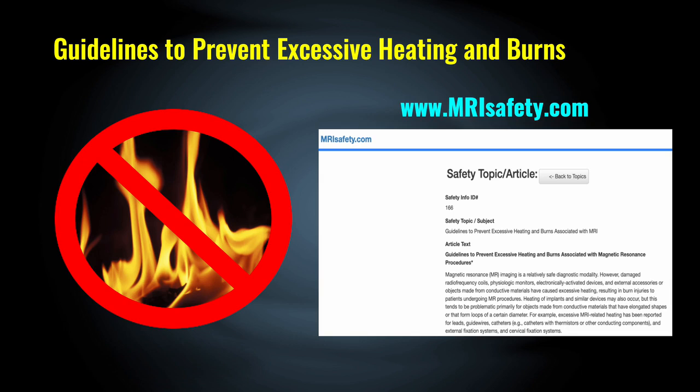The prevention of excessive heating and burns requires an understanding of the safety procedures for patient management, especially with respect to the proper use of transmit RF coils, monitoring equipment, as well as when electrically conductive implants and devices are present in patients.